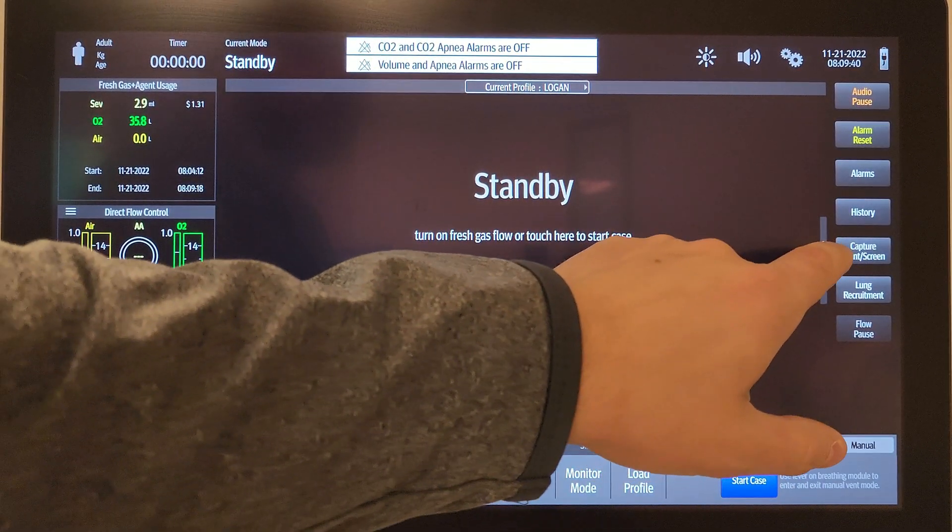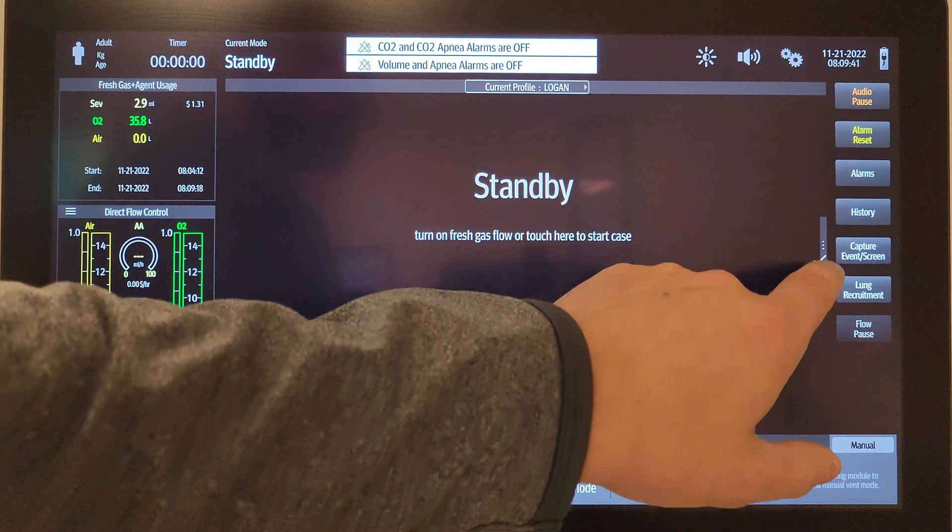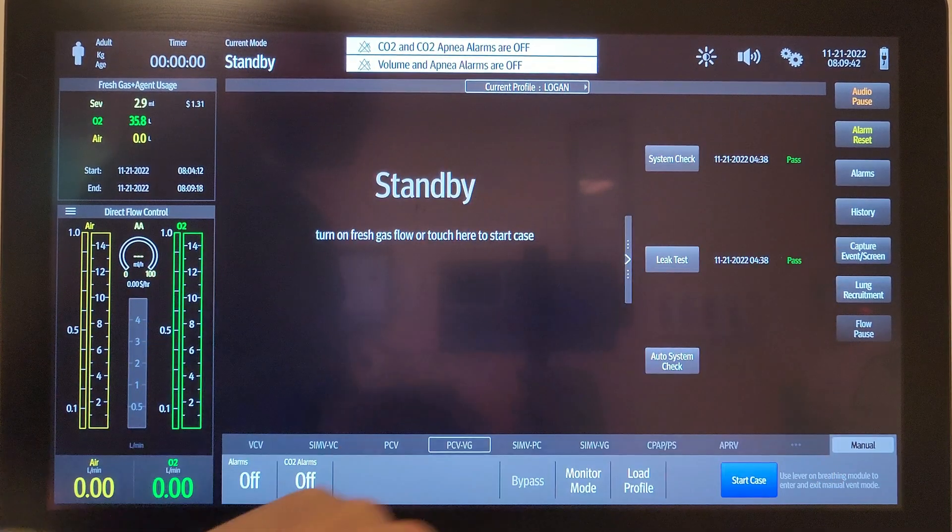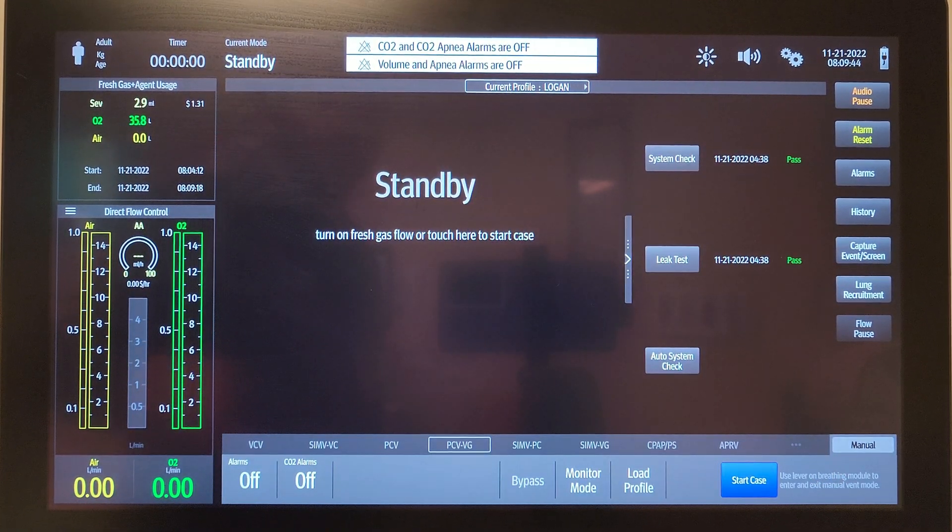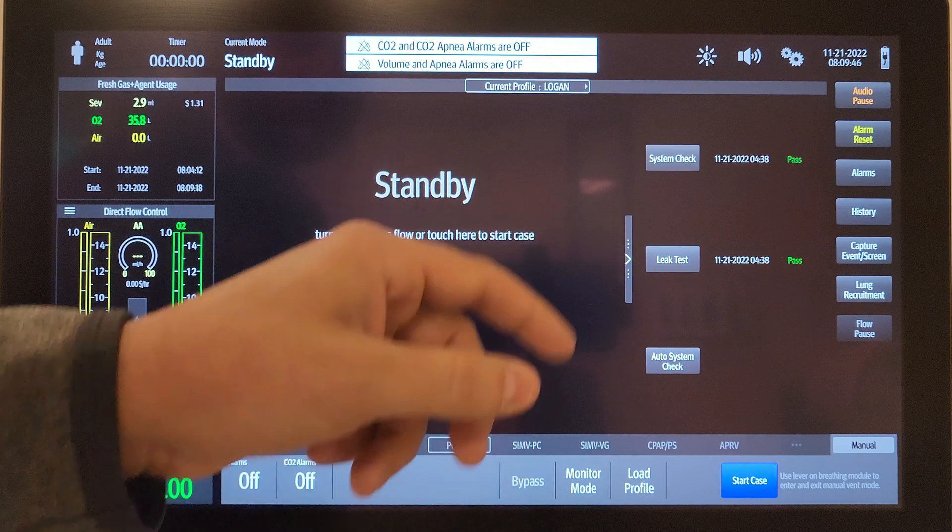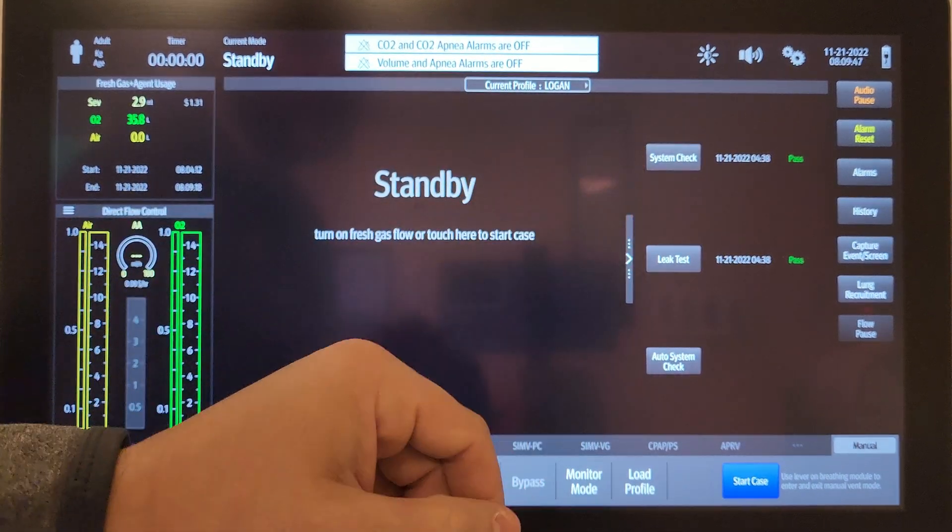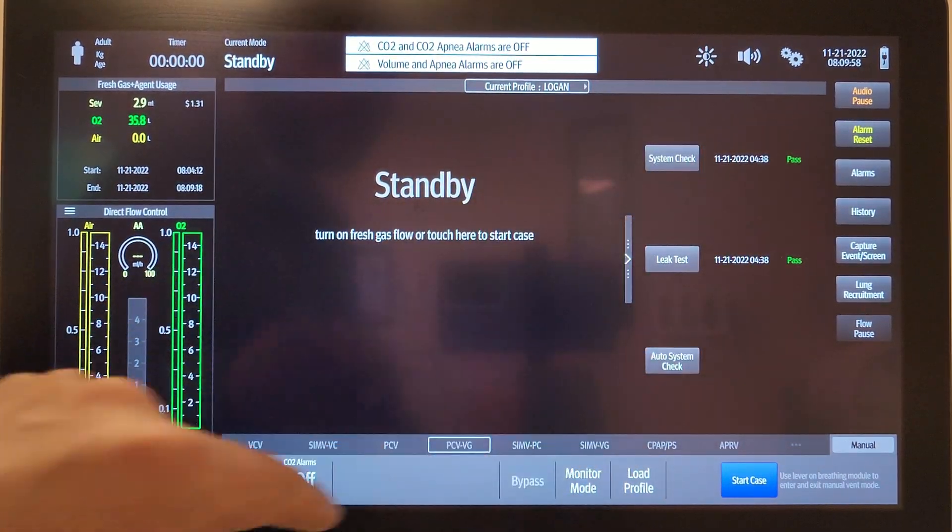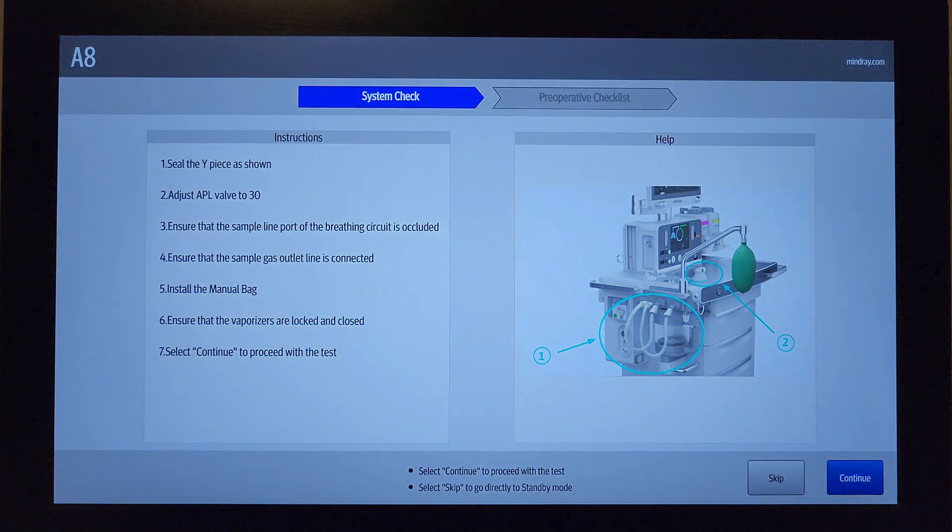You're going to click this little white arrow, that's going to pull this open, and now we're going to do a system test and a leak test. So we're going to click system check.